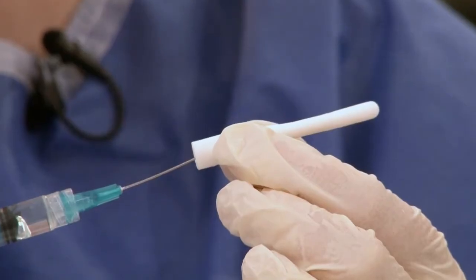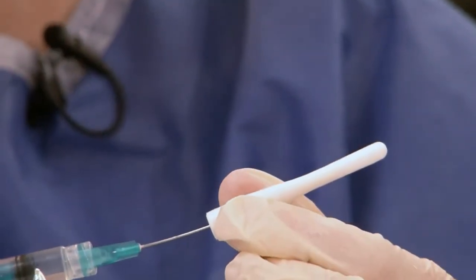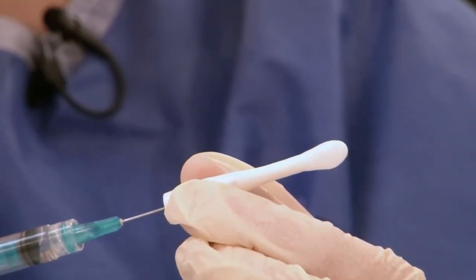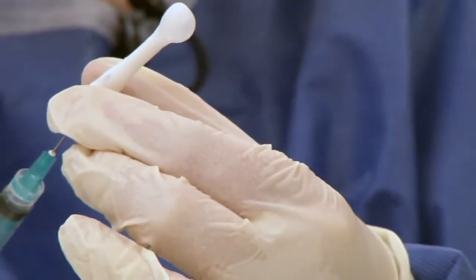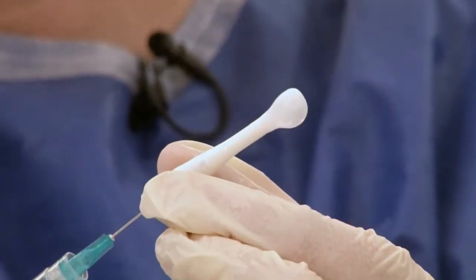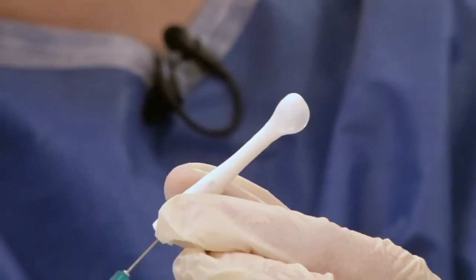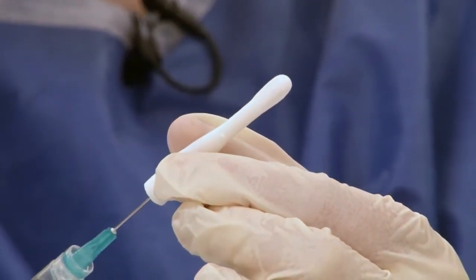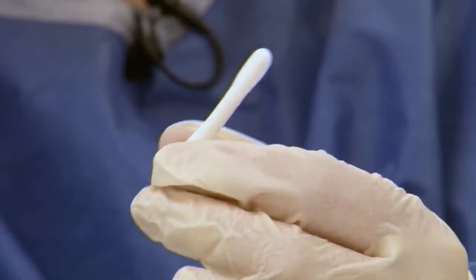Gently push it inside and then insert the water to make sure that the bulb inflates appropriately and does not leak. Then I'll remove it, much like a Foley catheter. Actually, a Foley catheter can be used to perform this if you don't have a Word catheter, but a Word catheter is what's recommended.